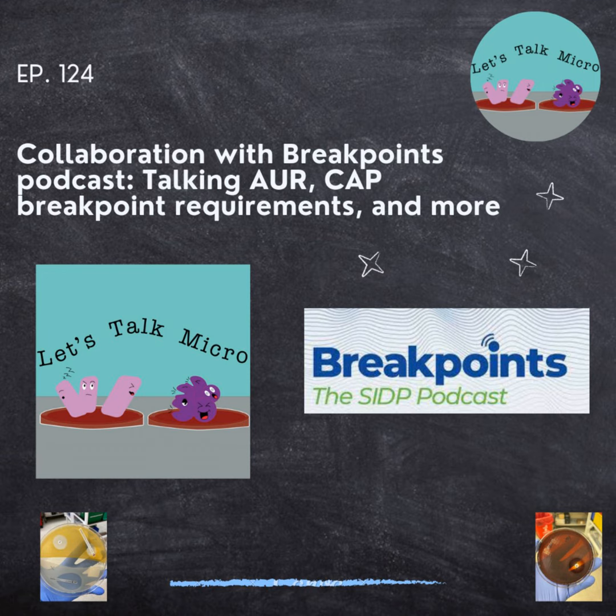The other important point is that some of the changes on breakpoints are going beyond susceptible, intermediate, resistant. Some of them have susceptible dose dependent and resistant. Depending on the laboratory information system that you're using, some of them don't have this option, susceptible dose dependent. So these are limitation barriers the laboratory needs to try to overcome in conversation with antimicrobial stewardship and with the IT team, because this could be a significant barrier for some of the breakpoint updates to be implemented.